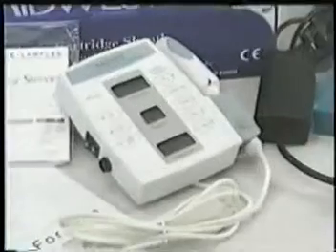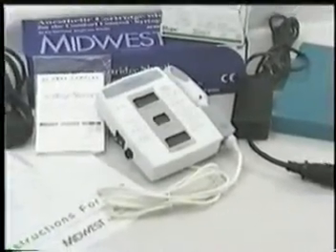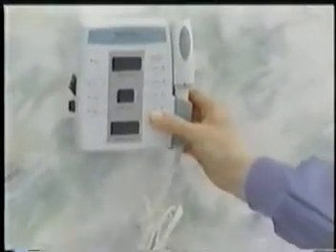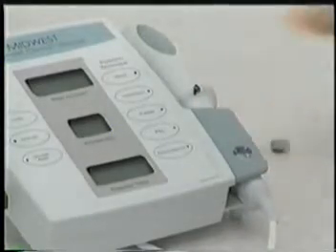Let's review the content. Installation is a breeze and takes longer to describe than to perform. First, decide on where on the counter or wall you would like your CCS unit located. If you elect to place it on the counter, remove the wall mount bracket. You may also remove the plug from the handpiece holder and use this as a needle recapping station.